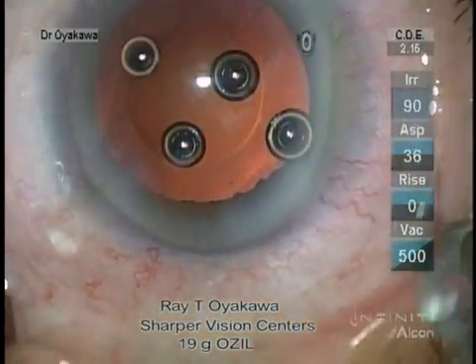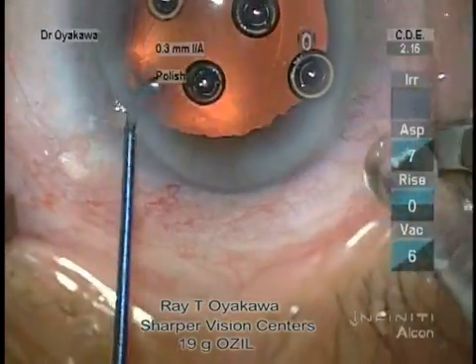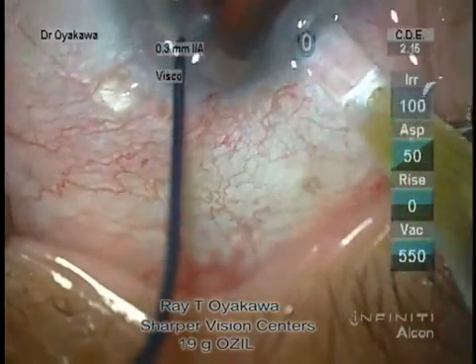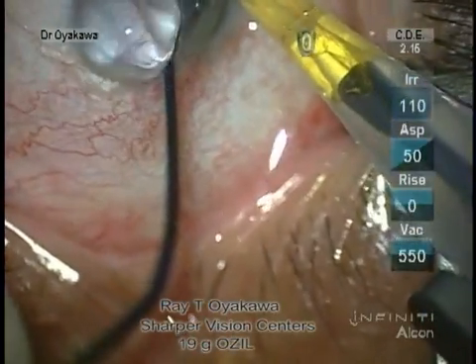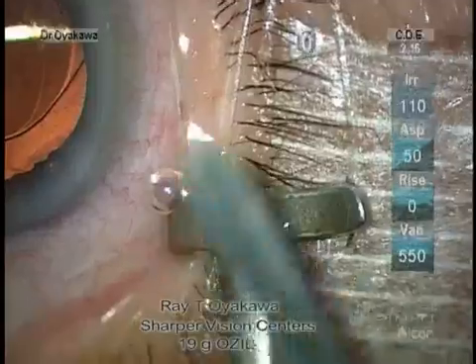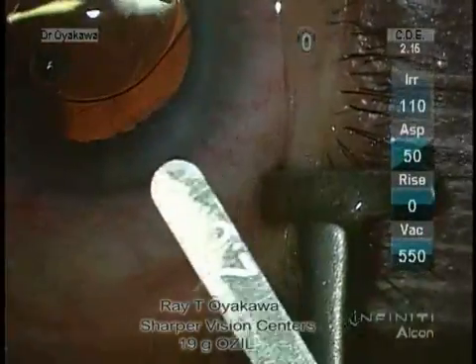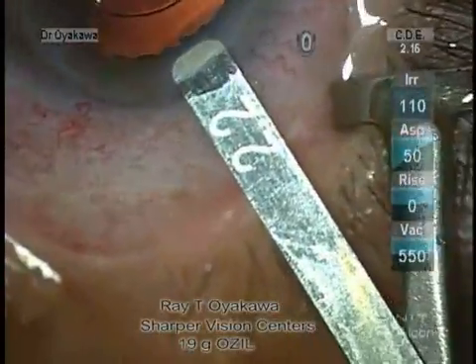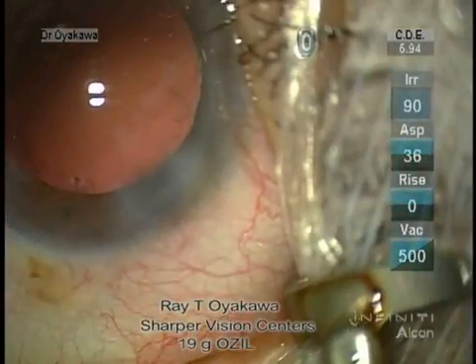This first lens that I injected was a 10 diopter lens, so it's a smaller size. The D cartridge is used and put right up to the wound. Counter-traction is applied. After insertion and removal of the viscoelastic, the wound measures over two millimeters but under 2.2, around 2.1.